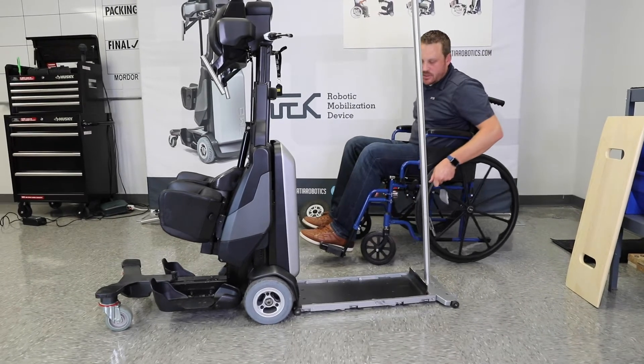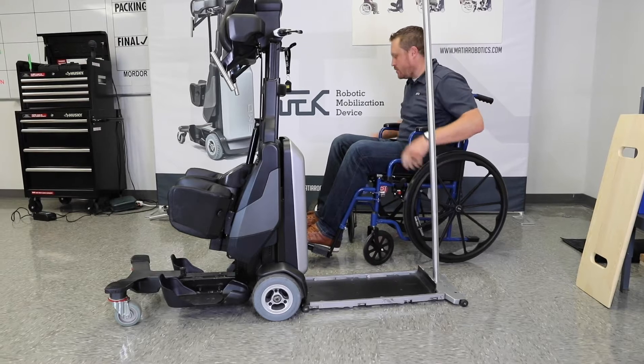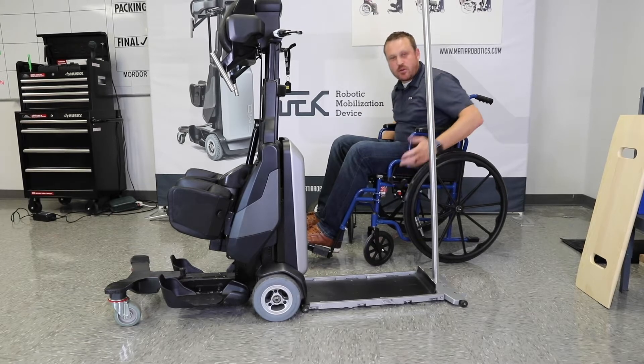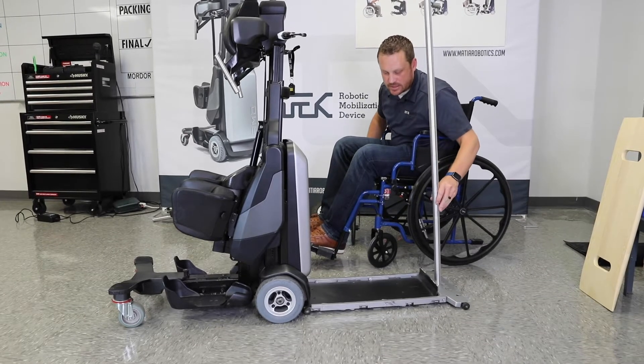We're going to demonstrate here changing from the indoor kit to the outdoor kit, and to change from outdoor to indoor it's basically the same process. I'm doing it from a wheelchair just to show that it can be done from a wheelchair without assistance.